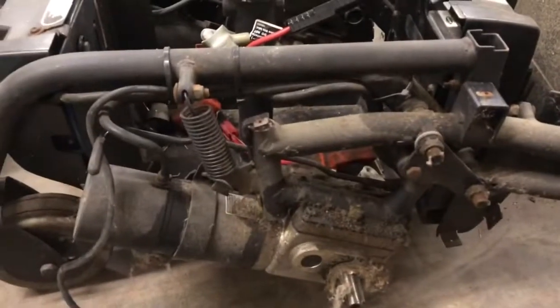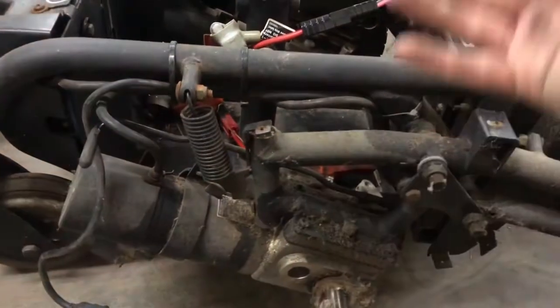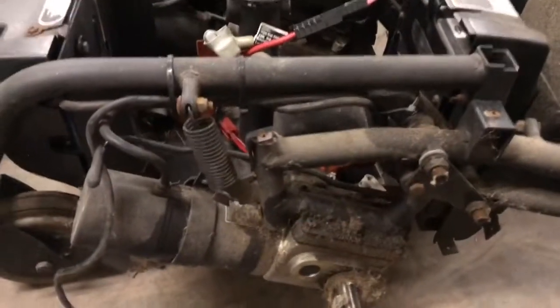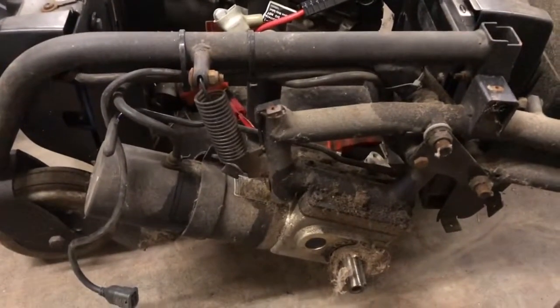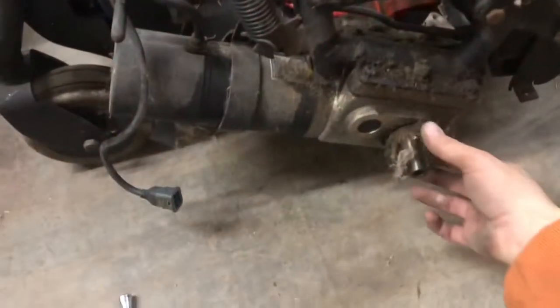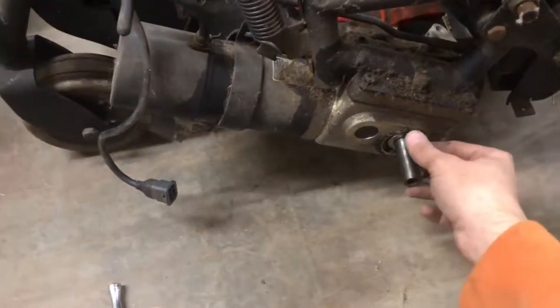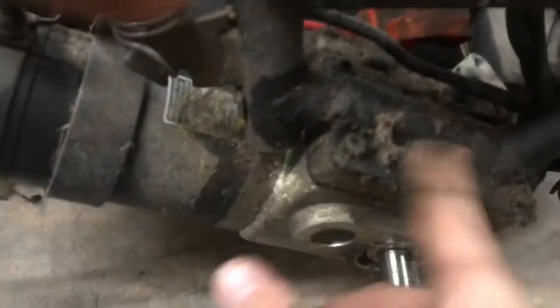I would say a gear puller, but on this particular tire, the way they made it, it would be hard to use one on it. So what I would do if it's stuck is spray some WD-40, flip the chair where it's laying on that tire, and wiggle it left and right, and pull up at the same time, and eventually it will come off. It's just hard work, and it's bad on your back, really. So go ahead and remove stuff from this.